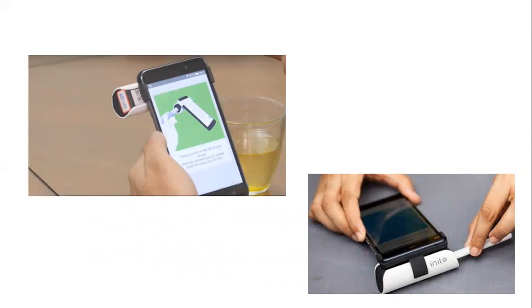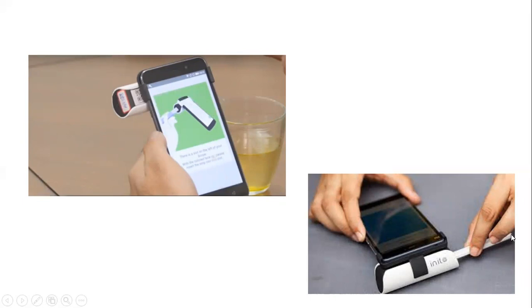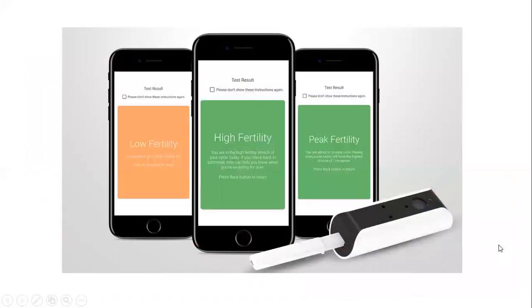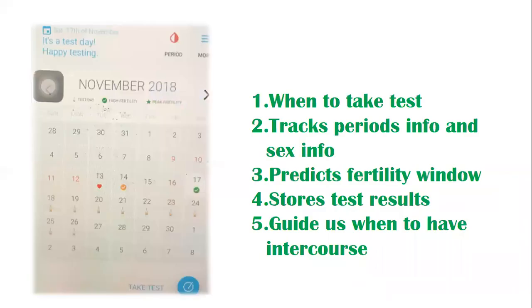When you cover the cap, you'll get an icon on the mobile app. Connect the app first to the device, send instructions from the app, then connect the strips to the device. It takes around 300 seconds to calculate the results. There are three results — low fertility, high fertility, peak fertility — and these results are stored in the app.